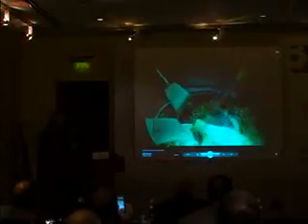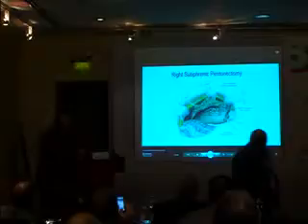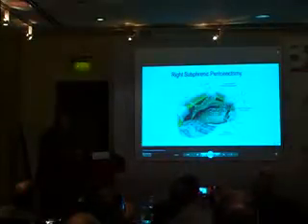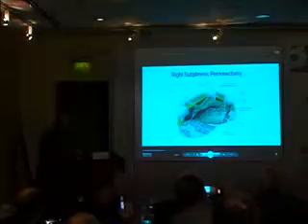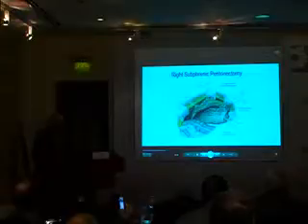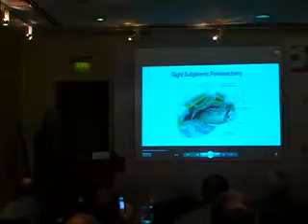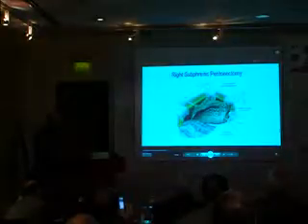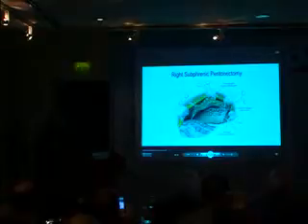This is the right paracolic sulcus, and we've taken down the undersurface of the right hemi-diaphragm. We will remove the tumor. I usually take the ball tip and kind of bend it, make a so-called hockey stick out of the electrosurgical tip.